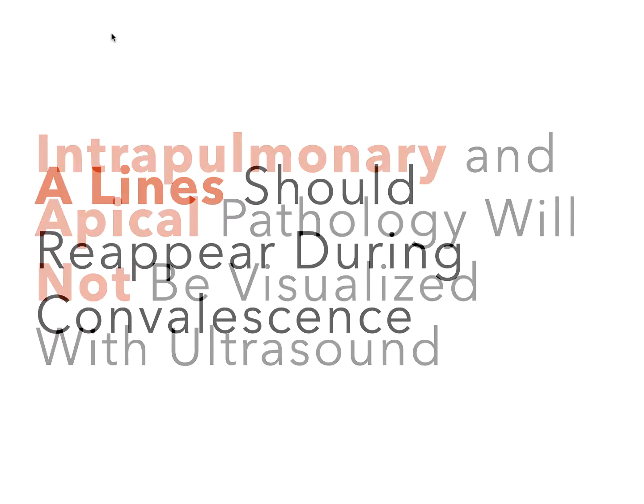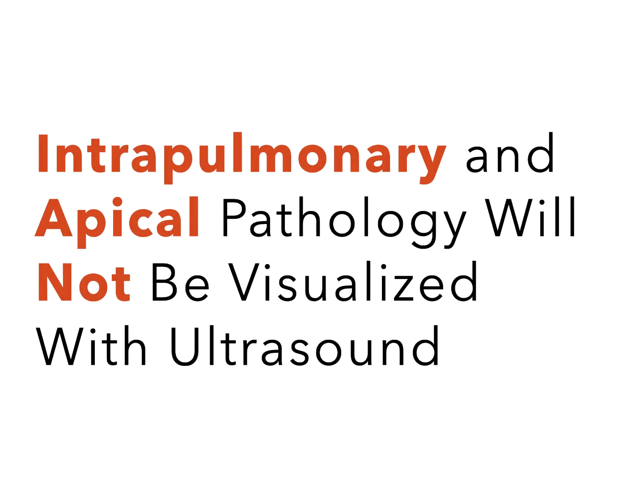The last point about lung ultrasound to remember is that intrapulmonary and apical pathology will not be visualized by the probe. Lung ultrasound is very effective for pleural-based lesions or consolidations that extend to the pleura, but it unfortunately can't visualize deep intrapulmonary lesions.